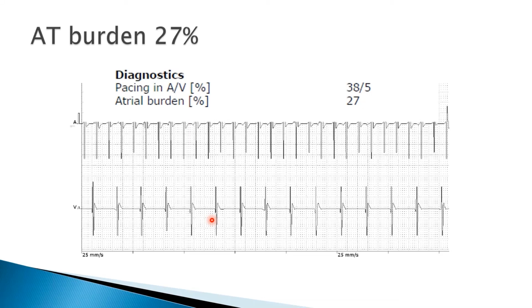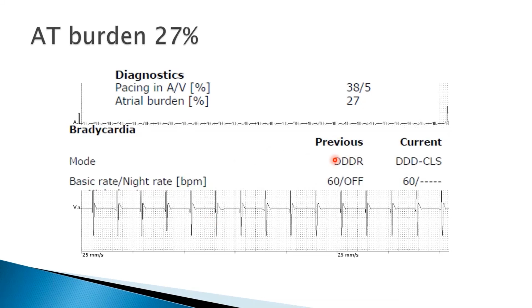But what we had is the patient was initially set, despite having a CLS enabled pacemaker, on DDD-R, which is the usual dual chamber rate adaptive mode. It utilizes open loop stimulation as the rate response instead of closed loop stimulation. Again, patients are not very keen for procedures, having gone through 3 procedures from EP to ASD closure to, of course, pacemaker implant. It is understandable.